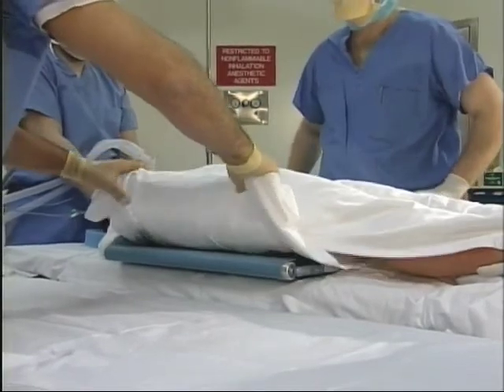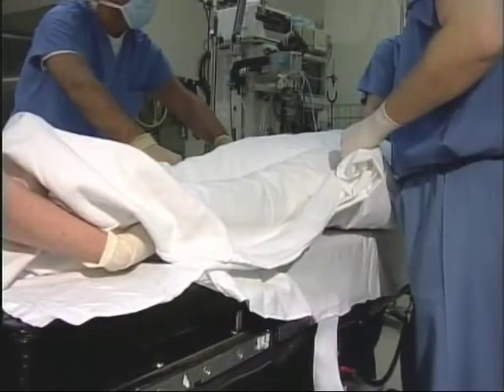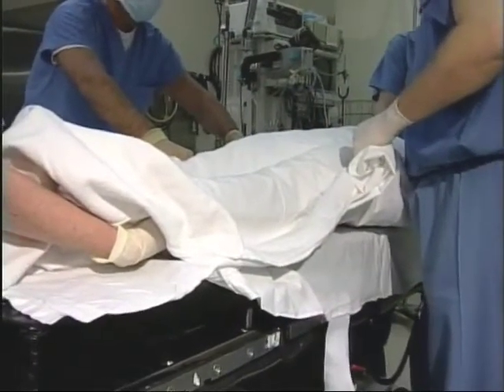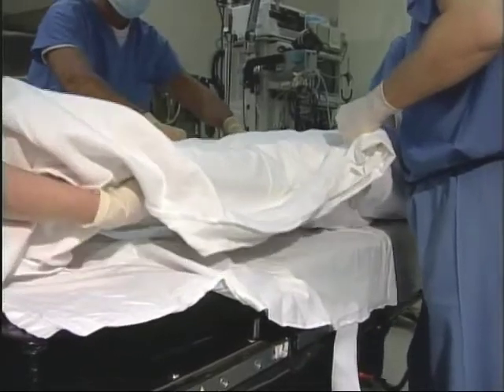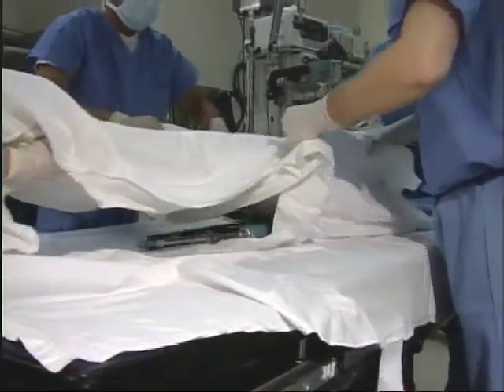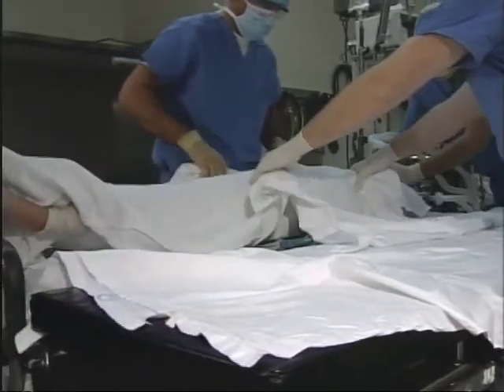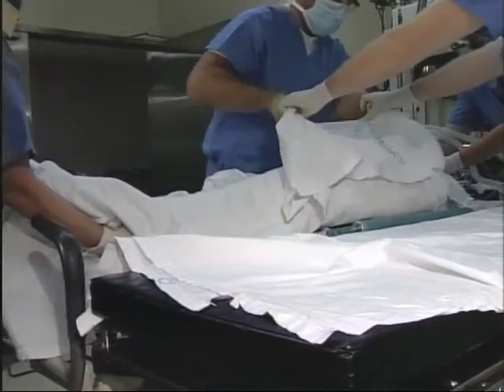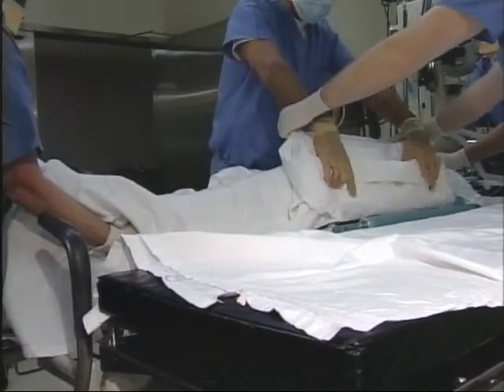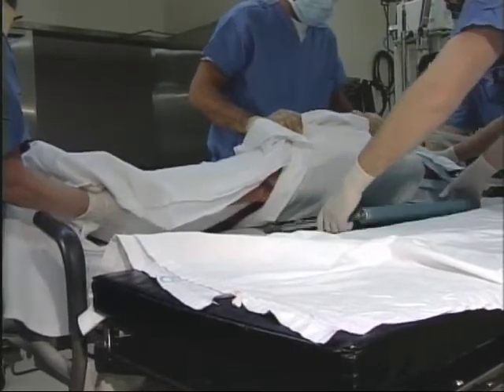The circulator and surgical assistant brace their bodies against the OR table and the gurney respectively to prevent slippage. The anesthesia provider will again signal when he is ready to complete the transfer. While the anesthesia provider supports the patient's head and the STSR supports her feet, the circulator lifts the draw sheet slightly and pulls her toward himself, while the surgical assistant slightly lifts the sheet and pushes her toward the circulator. The transfer device is removed.